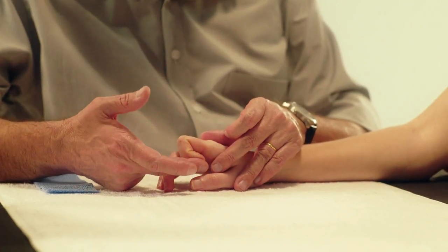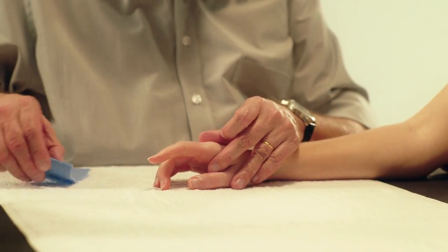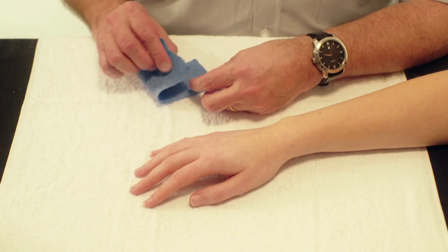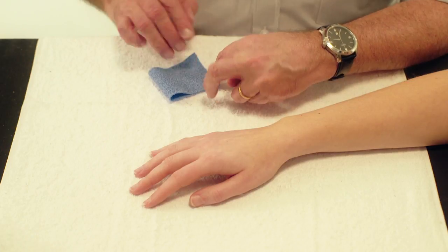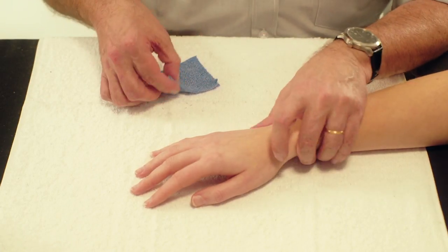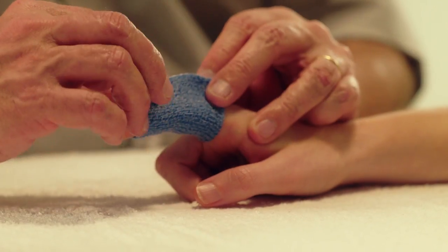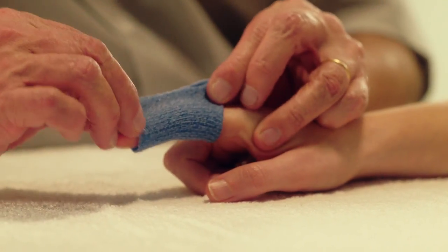Use a strip of orthicast six centimeters wide and 10 to 12 centimeters long. Fold the piece in half. Place the orthicast on the palmar surface of the finger and pinch together on the dorsal surface.